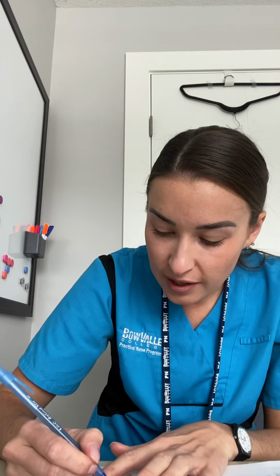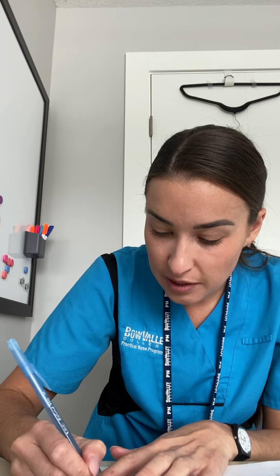So for assessment purposes, we're taping this on, but it would usually just stick. So we have that there. And then we're just going to do another check here. So we have now 0.9% sodium chloride with 4 milligrams of dexamethasone. We're giving it 4 milligrams IV piggyback, which I actually should write on here as well. So IV piggyback, the route, that's important. So there's my label now, sorry, IV piggyback.